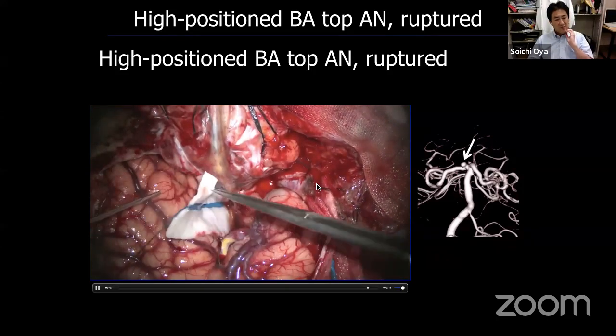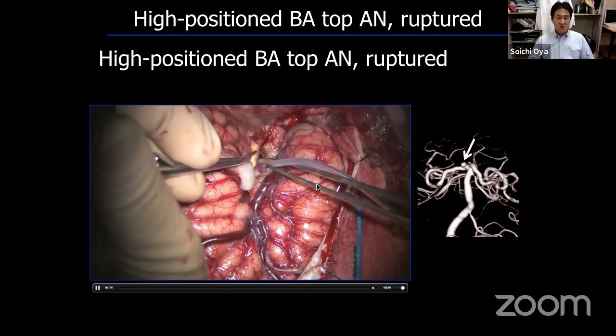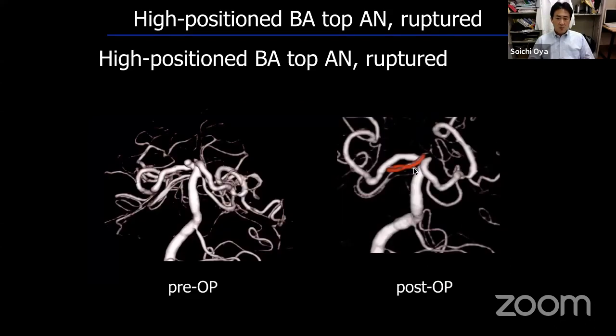And at the last step, in Japan, we frequently use the cisternal drainage to control the intracranial pressure. So I put the cisternal drain here. So the postoperative imaging showed complete disappearance of the aneurysm.